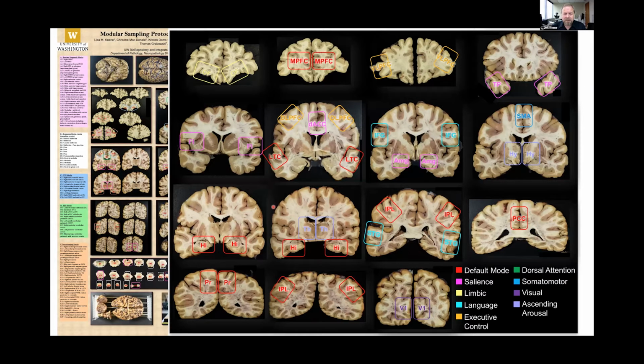The point is, we're taking a lot of samples. These are all in FFPE tissue, and we really need some way to manage this large amount of tissue, not just from a diagnostic perspective, but also from a quantitative perspective.